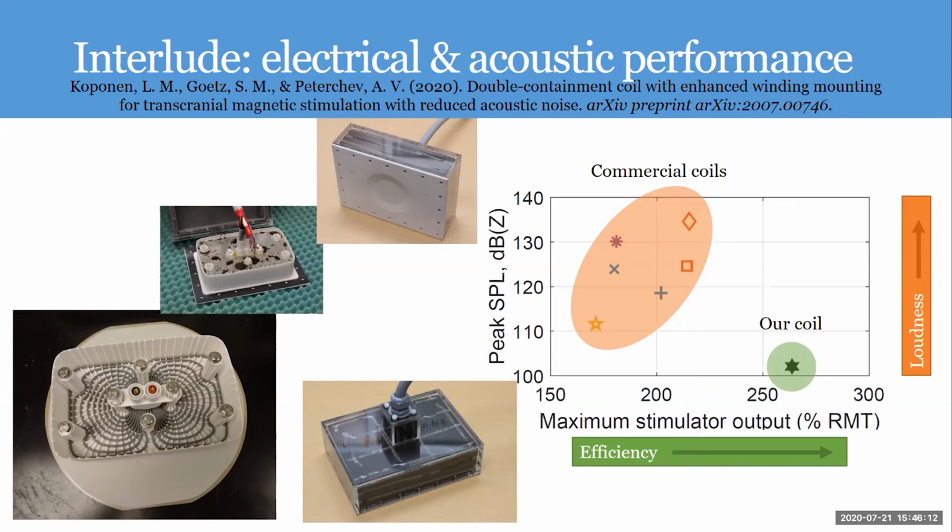And then of course here, the reason for these 4 holes is that they are located at points where this coil has minimum displacement, and those are actually mechanically coupled to the exterior because you need to mount the coil somewhere. So those would become a dominant point, and if you need 4 times more power in the coil, the leaking of the sound through the mounting might actually be already larger. Yep. The lowest single narrowband sound frequency is most likely partially leaked through those, and then exciting this thin lid here. Yeah, thanks.